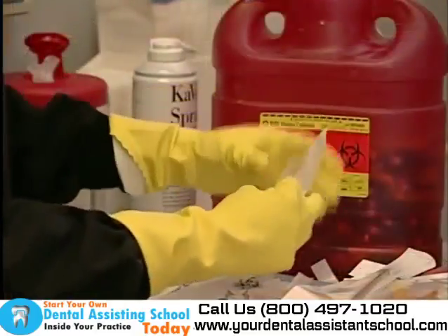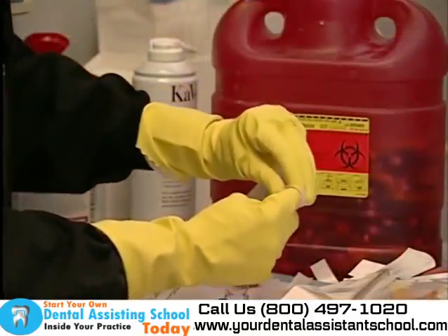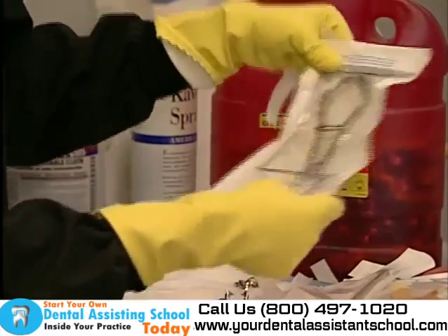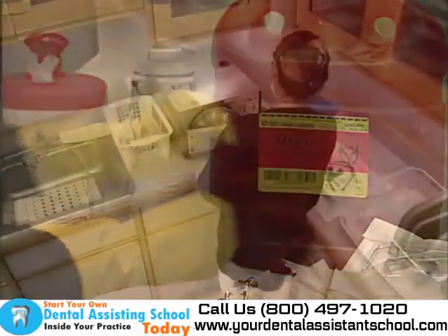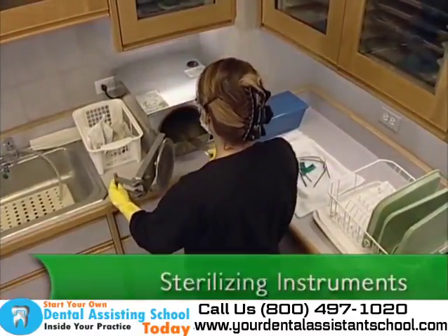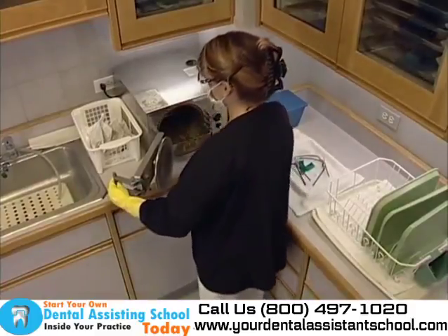Caution should be used when handling sharp or double-ended instruments. Puncture-resistant gloves should be used when cleaning sharp instruments. The next step is sterilization. The bagged instruments are placed into an autoclave for sterilization.